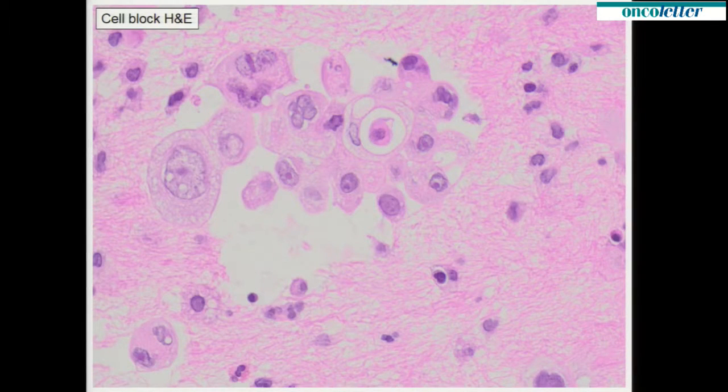And then the second step is now a cell block. The morphology looks a little bit different, but still good. And you can stain it first with H&E. Again, this is a typical adenocarcinoma surrounded by immune cells. Now then, what happens? This block actually goes into the archive in October.